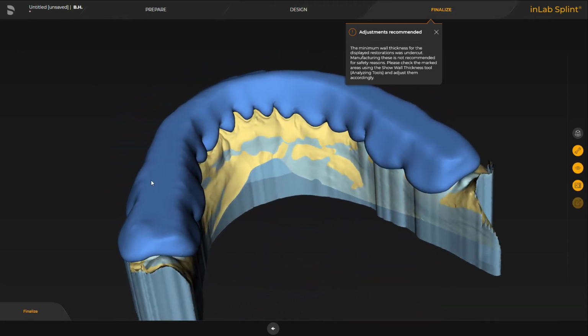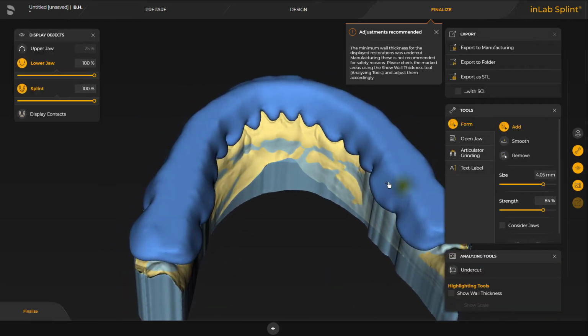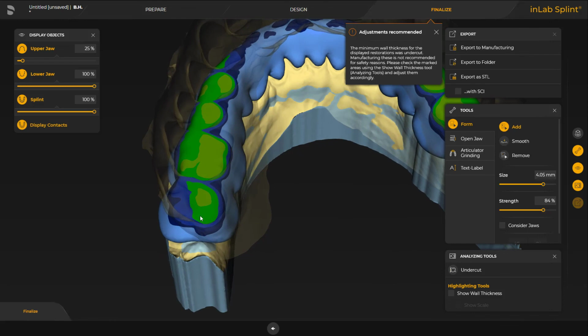To get a flat occlusion with a single contact point on the antagonist, I use my form tool, upper jaw, or just display contacts, and use the minus tool.